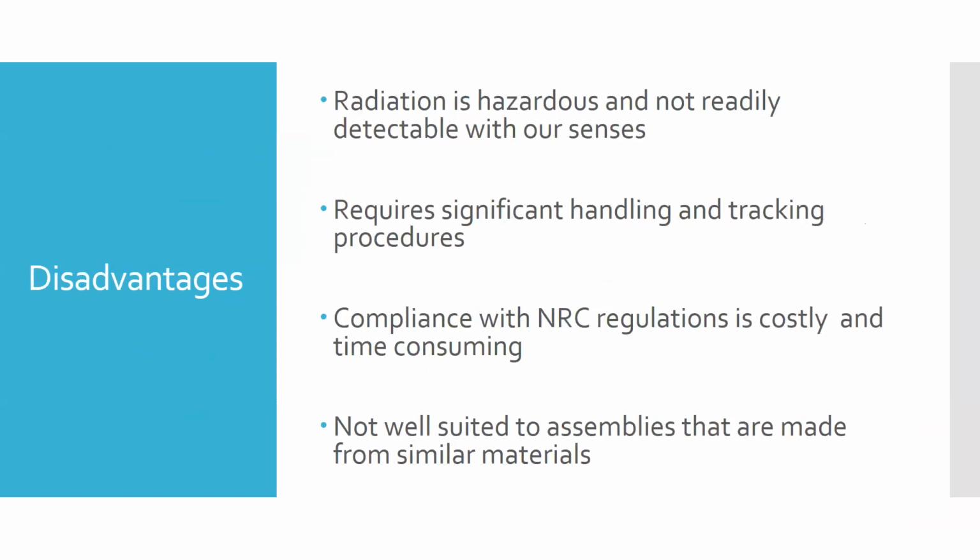In fact, I had an X-ray not too long ago when I had this knee stuff going on, and the detector panel they use is now wireless. They had an X-ray source they kind of put here, and the X-ray tech was able to just set basically a panel behind my leg, and it didn't have wires connected to it or anything. They could pretty much move it wherever they needed to. It was pretty cool.